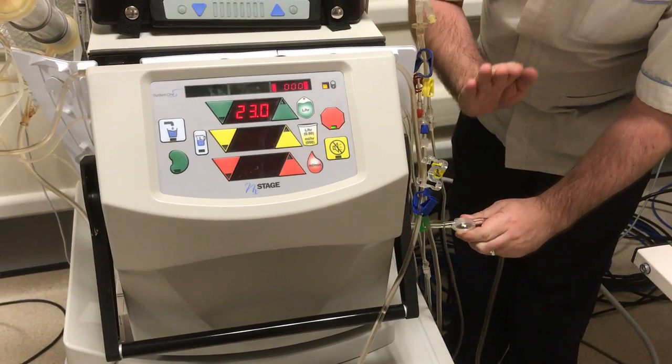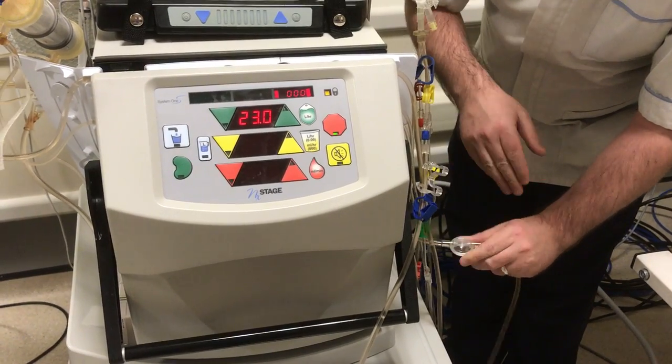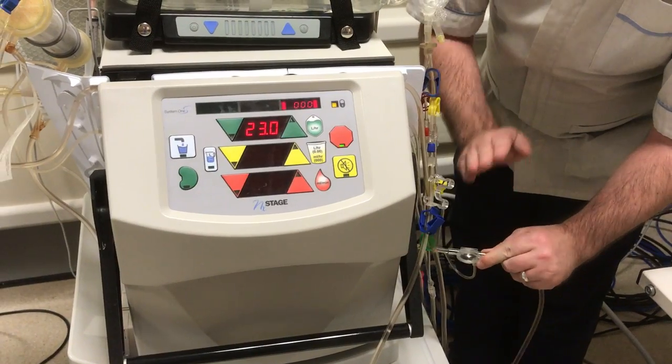We turn the pressure pod over and we smack it three times: one, two, three. We twist back: one, two, three. Twist back and again.